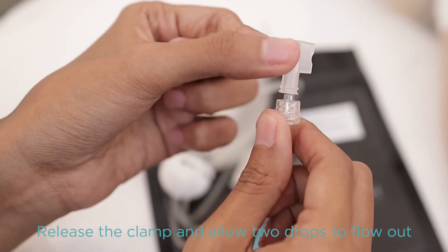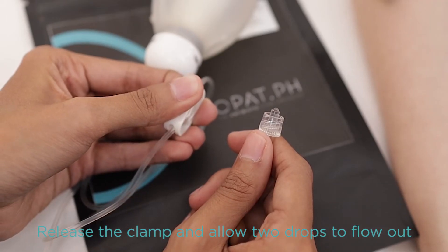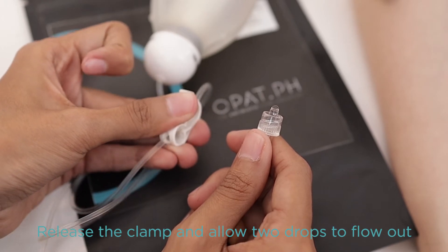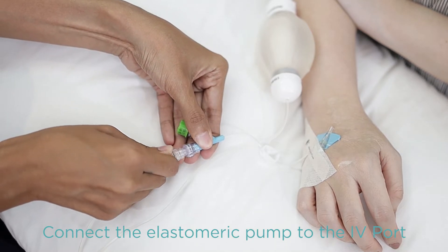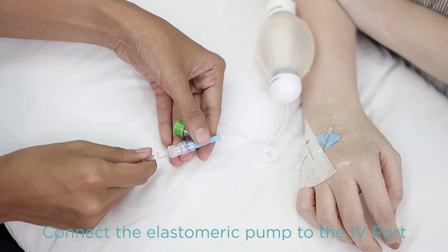Release the clamp of the tubing of the elastomeric pump and allow two drops of fluid to flow out. This indicates that the pump is working and ready for infusion. Now, attach the elastomeric pump connector to the port connector of the peripheral IV line.